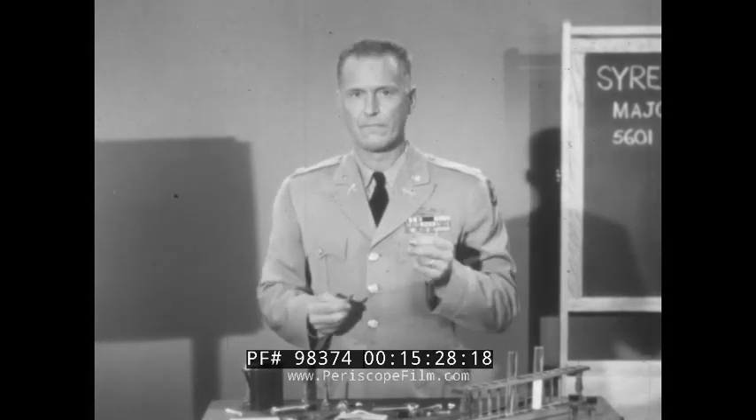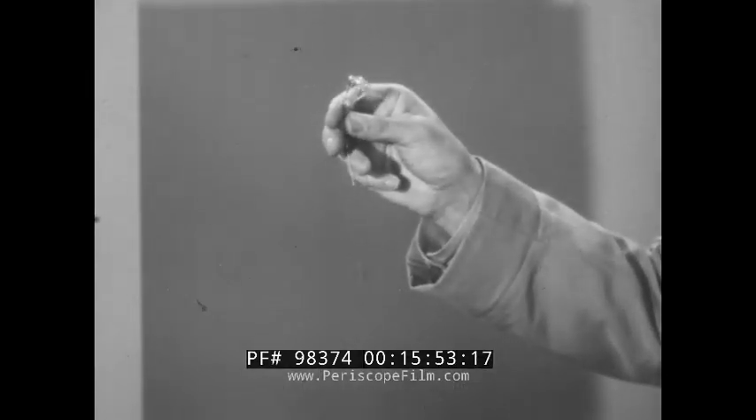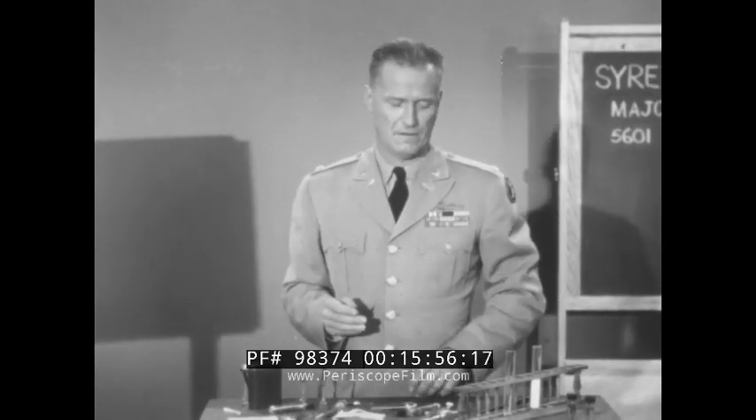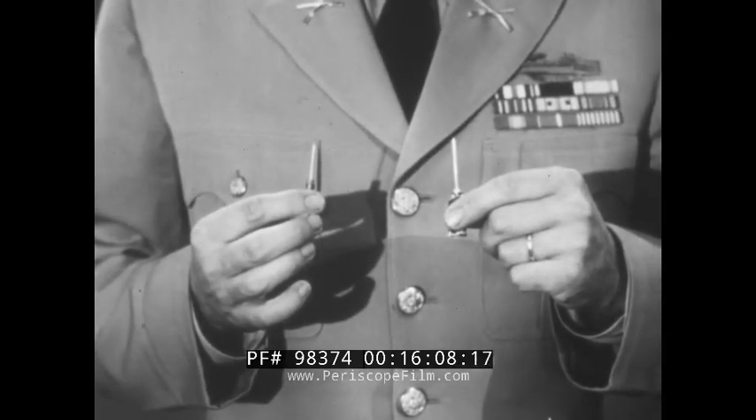Second, the ampin: hold the ampin bottoms up, straight up and down. Push the needle in all the way and then make certain the bottle is still bottoms up before and after you break the neck of the bottle. This is the only position in which the gas will force the atropine out of the bottle and into your muscle where it must go. Whatever you think about needles, they can help you stay alive. These needles are your best possible friends if and when you need them.